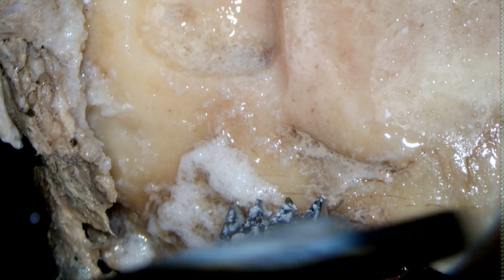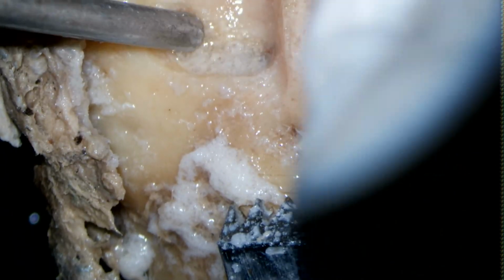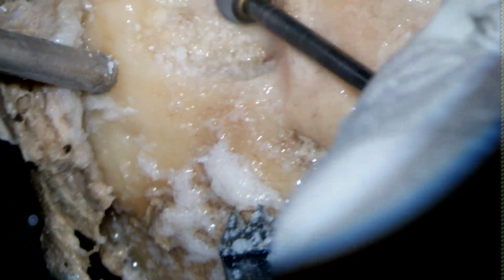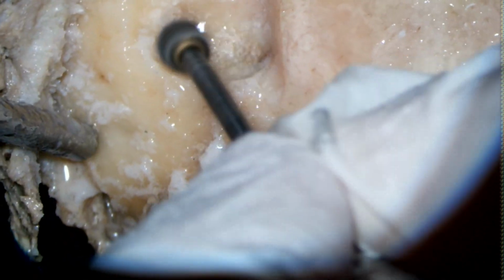When you are drilling, you should always see that you are saucerizing the edges and you are not going into a tunnel, right? That is important. And use the side of the burr to drill.